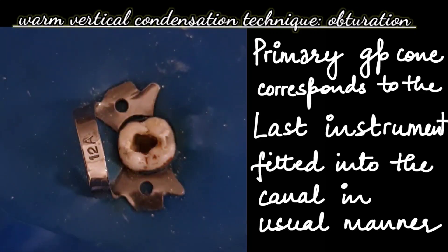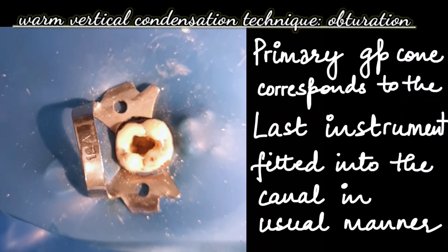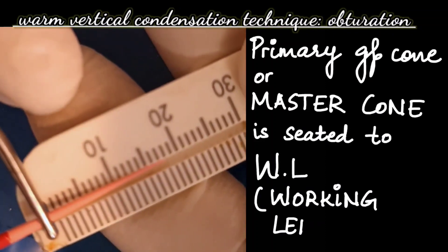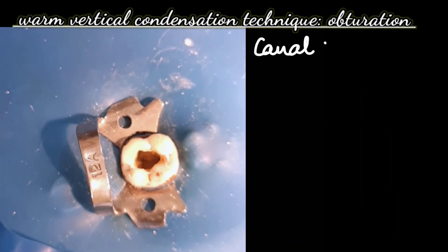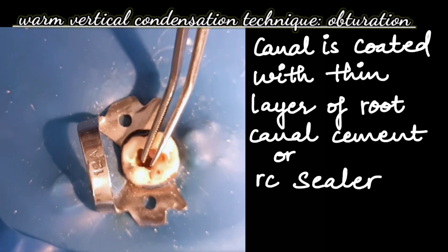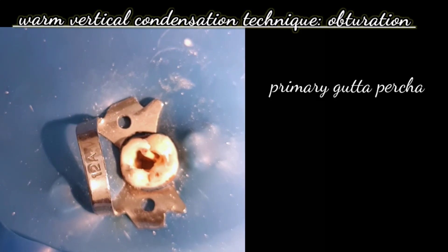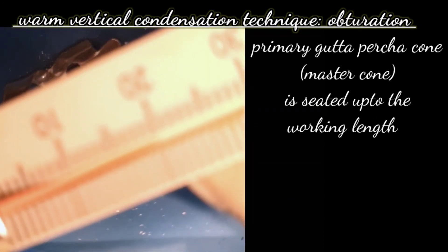With a single cone technique, we place a single cone, heat it, and fit it into the canal — this is the basis of the warm vertical condensation technique. A primary gutta-percha cone corresponding to the last instrument is fitted into the canal to the working length. We take the gutta-percha to the working length and coat it with root canal sealer. As you can see, this gutta-percha is coated with root canal sealer and fitted into the canal. The master cone is seated up to the working length of the canal, and we do this with all the canals.